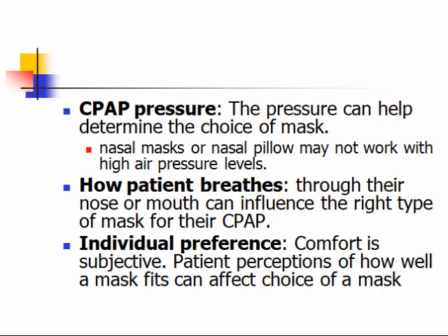Also, how the patient breathes. Definitely can't use a nasal mask or a nasal pillow if this person is a mouth breather. How they breathe can influence the right mask that you need. And then it gets down to the individual preference, what the patient perceives is the best for them.